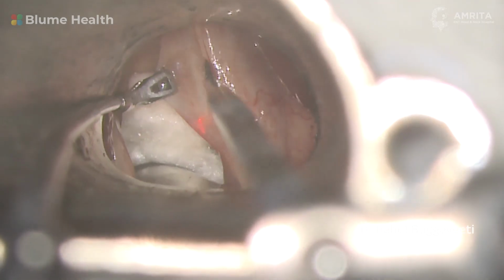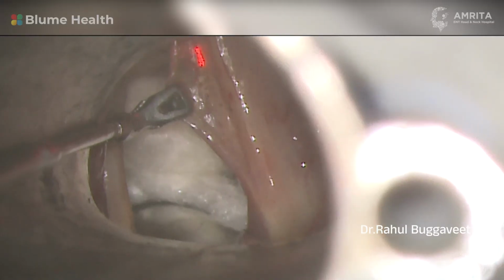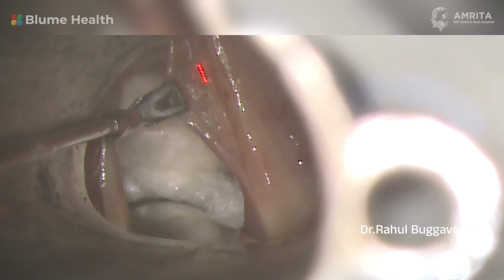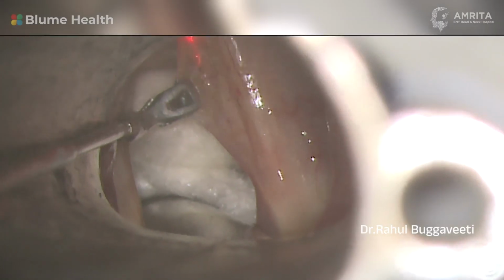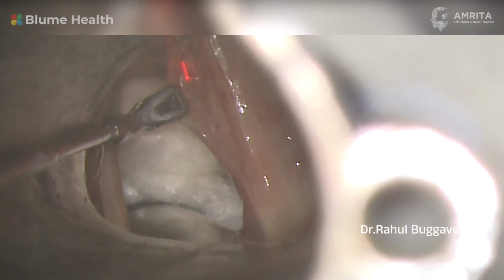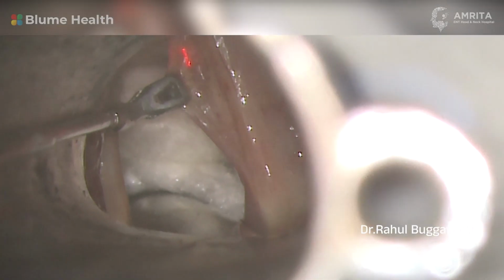Most of the times these cysts are very friable and they rupture during surgery, but the whole idea of the surgery is to remove the complete cyst wall. If you leave behind part of the cyst wall, that will again cause recurrence of the cyst. So with the help of CO2 laser, we are gently separating the cyst wall from the mucosa and from the vocal ligament. This is done sequentially.